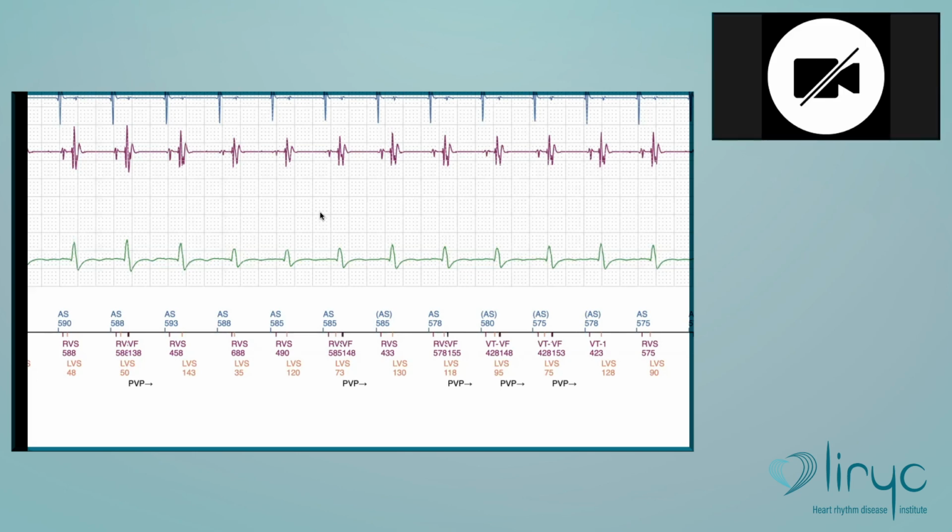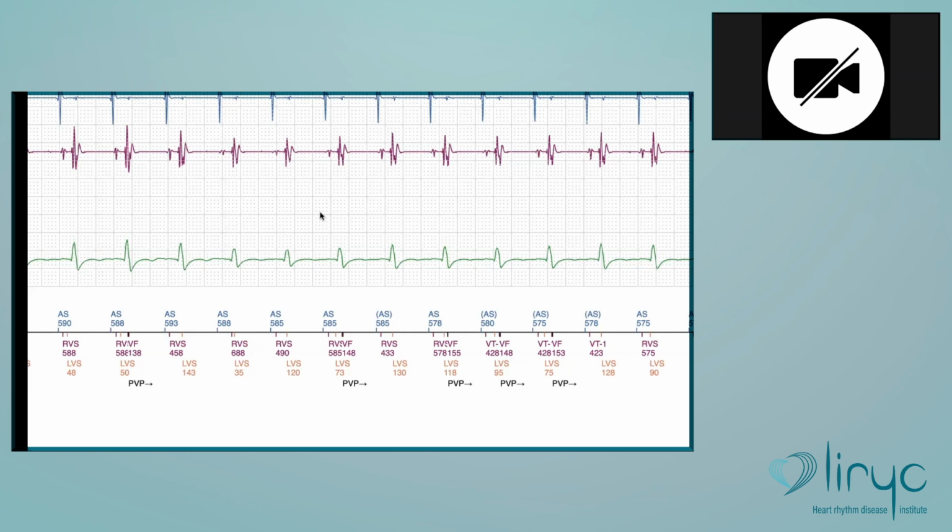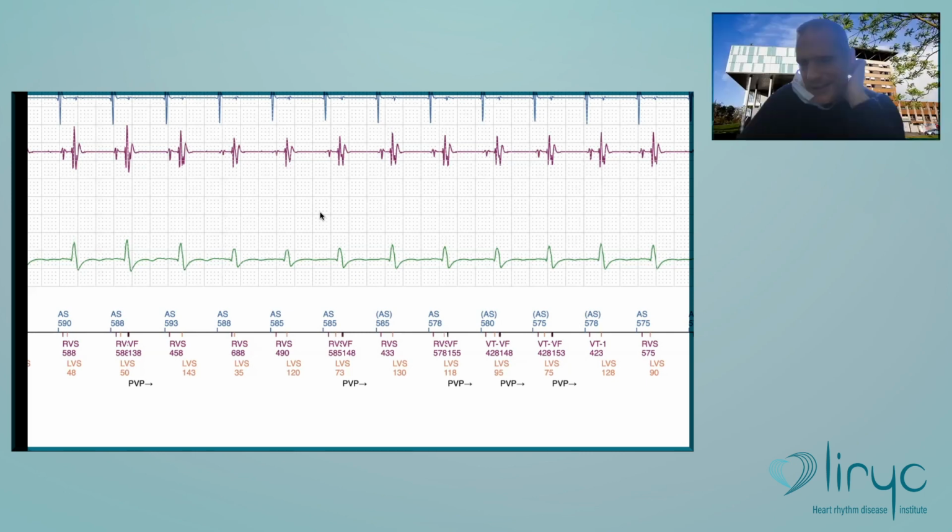Assuming it's a Boston lead also? Yes, because of the integrated bipolar configuration. If you look at any textbook on ICDs and interrogation of ICDs, most of the time P-wave oversensing is illustrated with a case of a Boston Scientific device because of the leads, since you sense between the tip of the lead and the coil. If the coil is straddling the tricuspid valve, then you increase considerably the risk of P-wave oversensing.